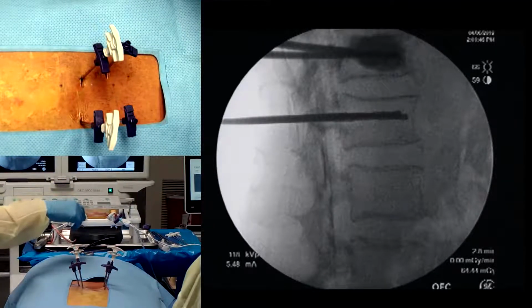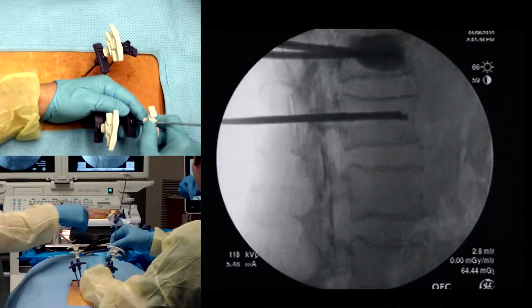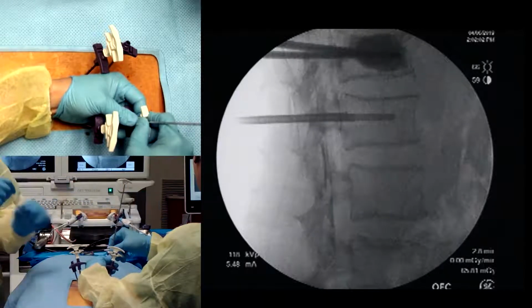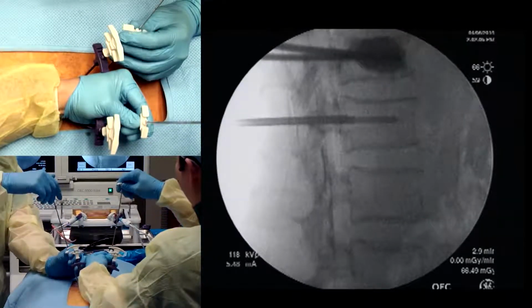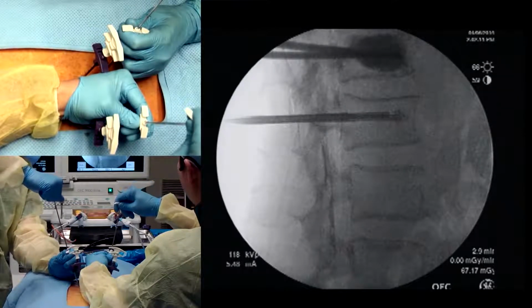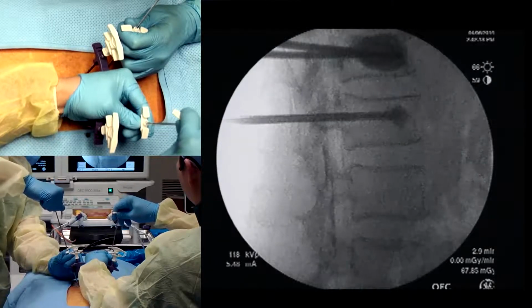It's a little thick. This is a vertebroplasty. This is from the previous one? Yeah, this is from the previous. Ooh, it might be thick. Yeah, it might be a little thick. So this is going to be vertebroplasty. So that we have not created, can I see a shot? a pocket. So the filling characteristics of this is going to be very different. There we go.